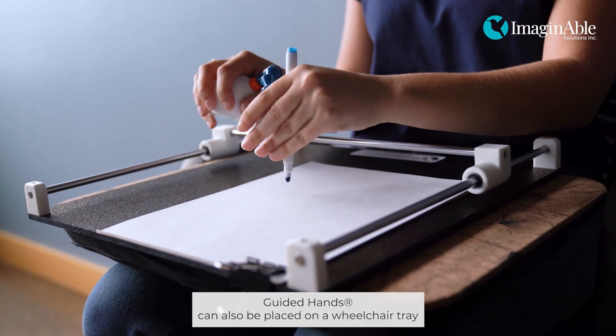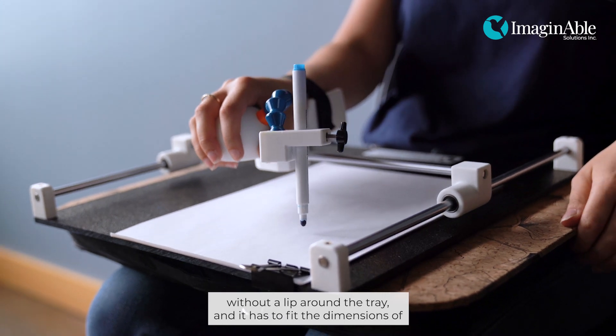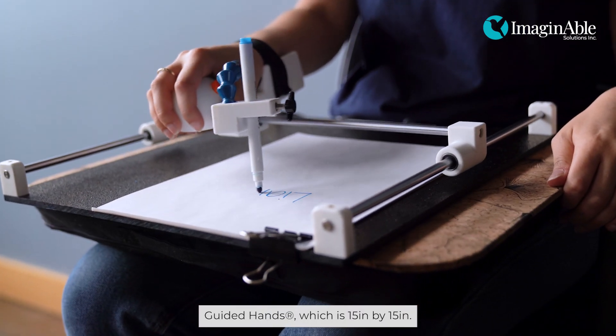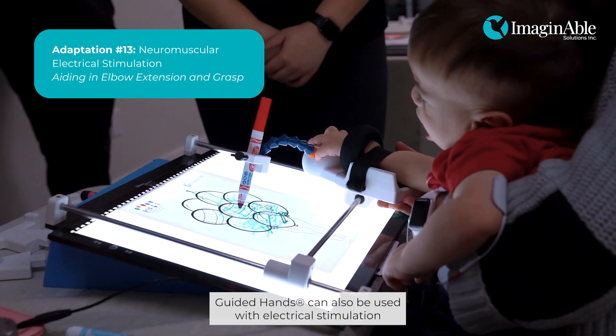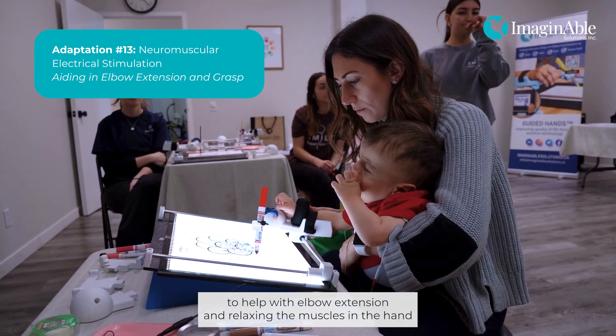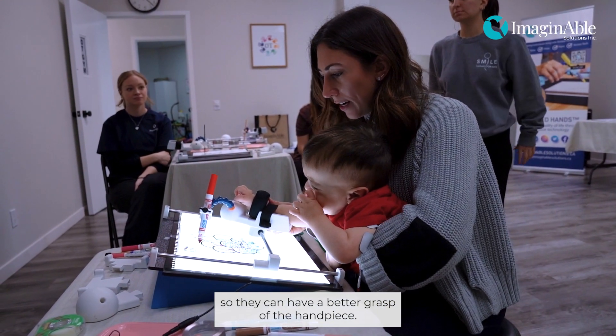Guided Hands can also be placed on a wheelchair tray — without a lip around the tray — and it has to fit the dimensions of Guided Hands, which is 15 inches by 15 inches. Guided Hands can also be used with electrical stimulation to help with elbow extension and relaxing the muscles in the hand so the individual can have a better grasp of the handpiece.